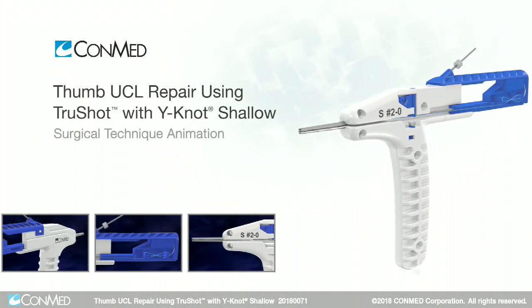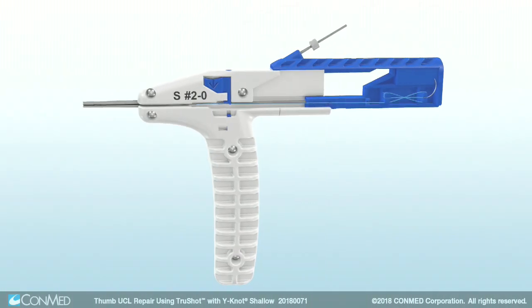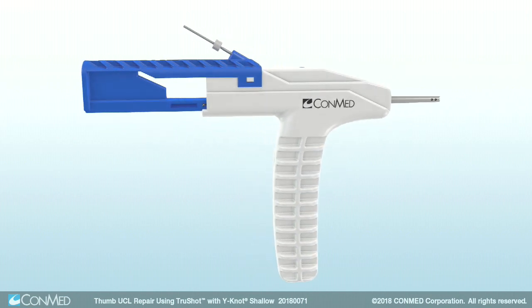Conmed's TruShot Y-Knot Shallow All-Suture Anchor is designed for small joint soft tissue fixation and can be used to simplify ulnar collateral ligament repair of the thumb.